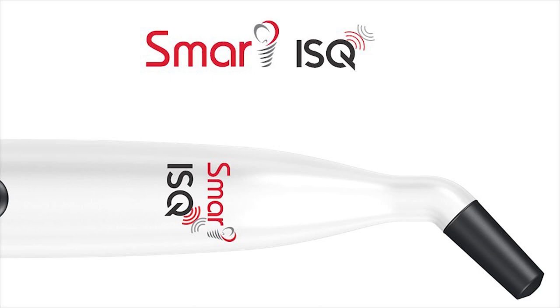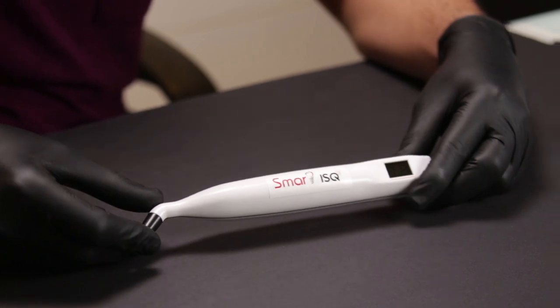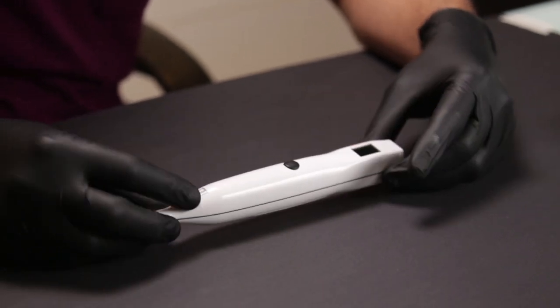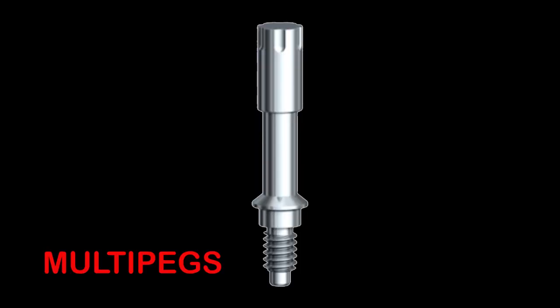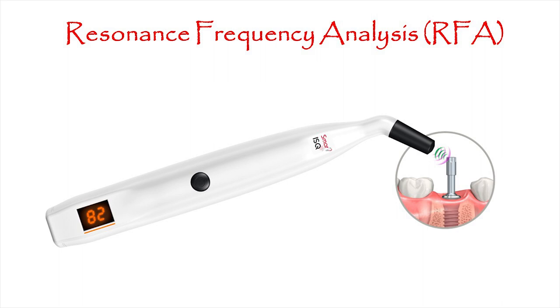There are two basic components to this system. The first is the Smart ISQ device itself, which is extremely compact, rechargeable, and completely wireless — it can be used easily without any assistance. The second component is the multi pegs, which get engaged into the implant and are used as a medium to determine the ISQ value. RFA makes use of a multi peg attached to the implant and excited by electromagnetic waves to measure the resonance frequency, helping us decide whether we can load the implant or not.